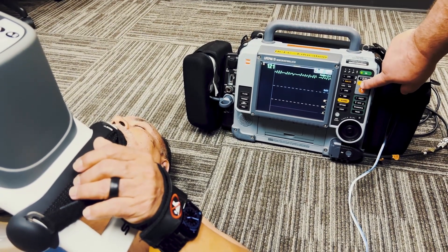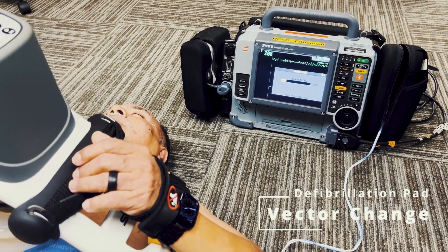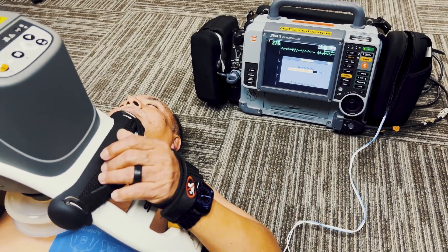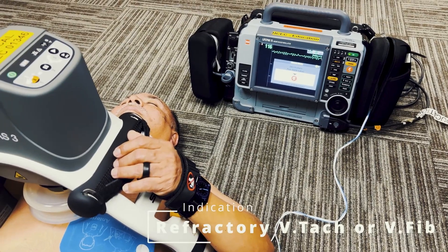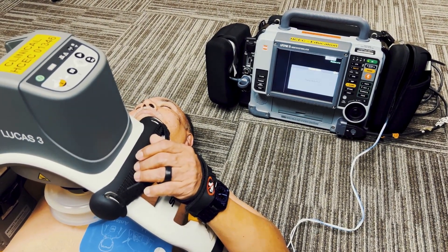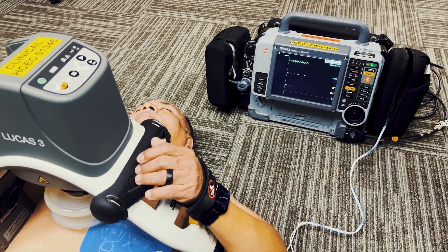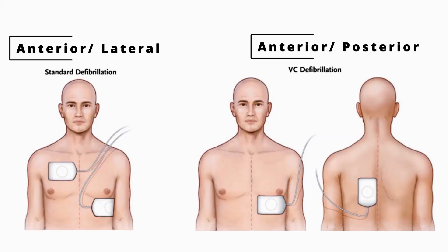Welcome to our demonstration on how to change defibrillation pad vectors during cardiac arrest resuscitation for patients experiencing refractory VTAC or V-fib. Perform the vector change if the patient remains in VTAC or V-fib after the third consecutive defibrillation. A new set of pads will be placed in the anterior-posterior position.